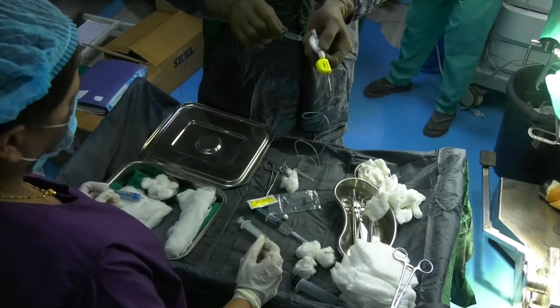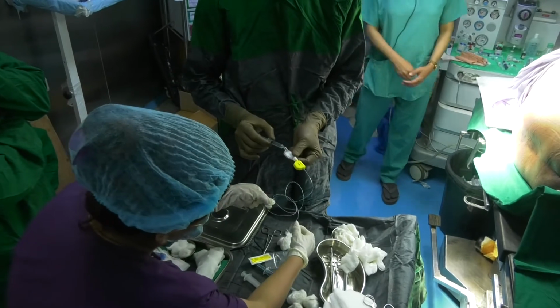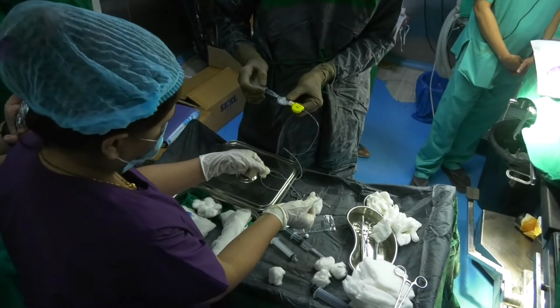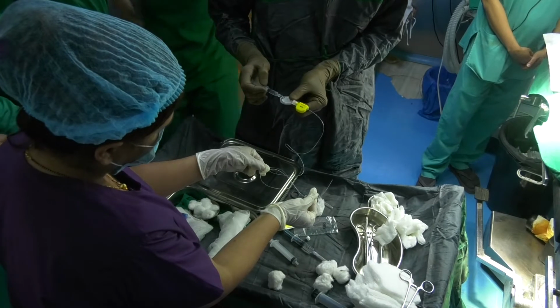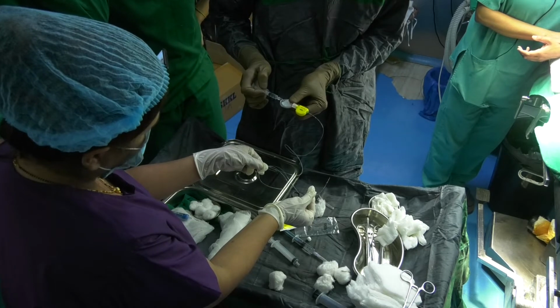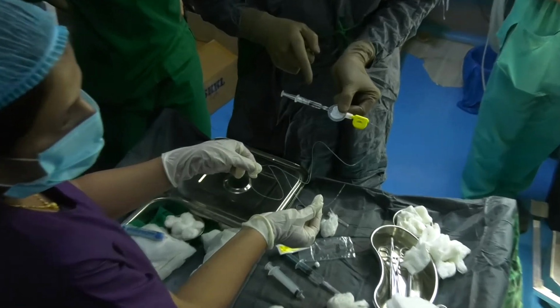You can see I have taken 2 ml of this, and I am pushing the drug. You will see that after 1 ml it will come there. Just 1 ml.